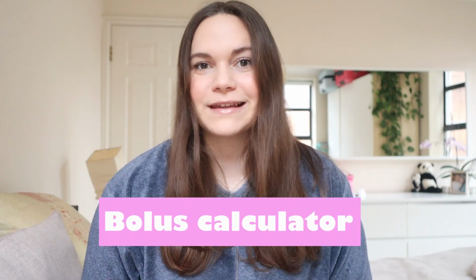The second thing I love about being on an insulin pump that has taken so much work away from me is the inbuilt bolus calculator. I love this, and some blood testing kits will have that inbuilt bolus calculator on, but if you're using a CGM, you're not going to have that, especially not on the Libre anyway. That's the system that I use, and there's no bolus calculator on there. So having a bolus calculator on the pump is so useful because I don't have to do any maths.